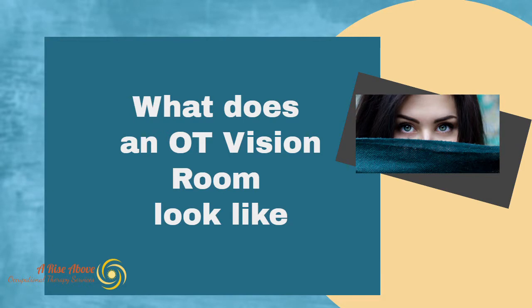Today we're going to talk about what an OT vision room actually looks like, whether you're a treating therapist or a patient who needs to work on their vision.